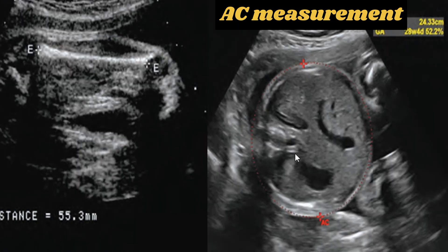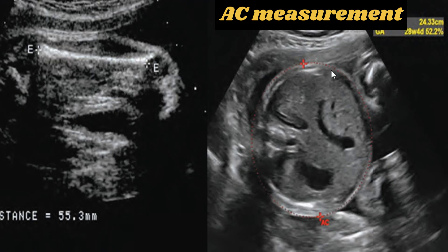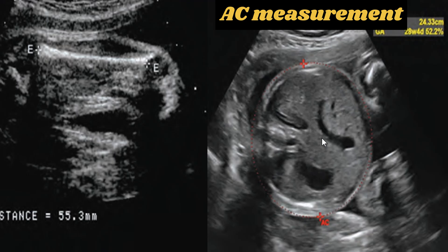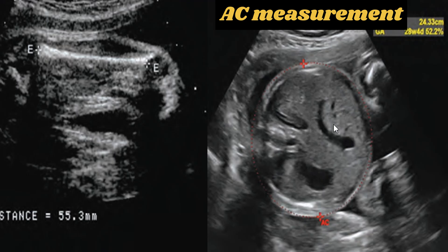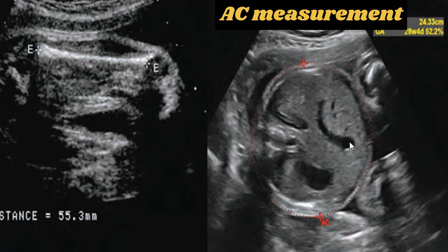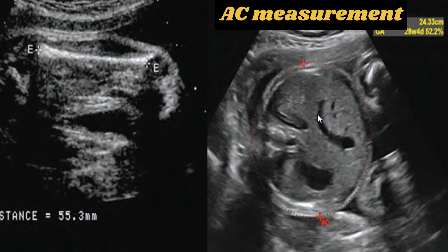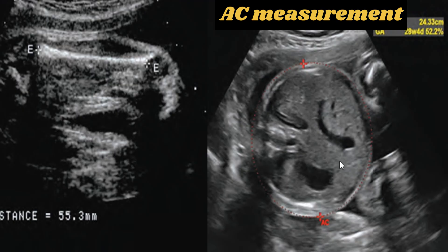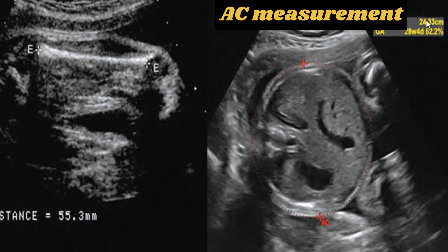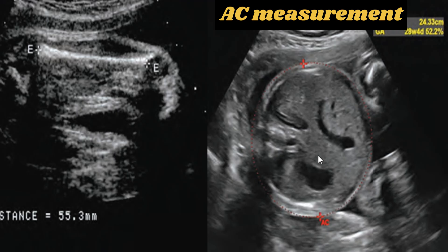Now we are going to discuss the abdominal circumference measurement. The fetal abdomen is measured in the axial plane at the level of the stomach. When possible, the curve-shaped vascular structure comprising the junction of the umbilical portion of the left portal vein with the portal sinus and the right portal vein should be seen. The abdomen should show a rounded configuration, and here it measures about 24.3 cm, corresponding to 28 weeks and 4 days.